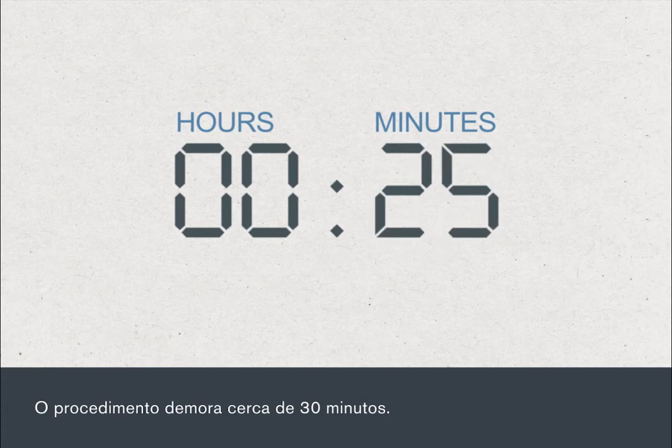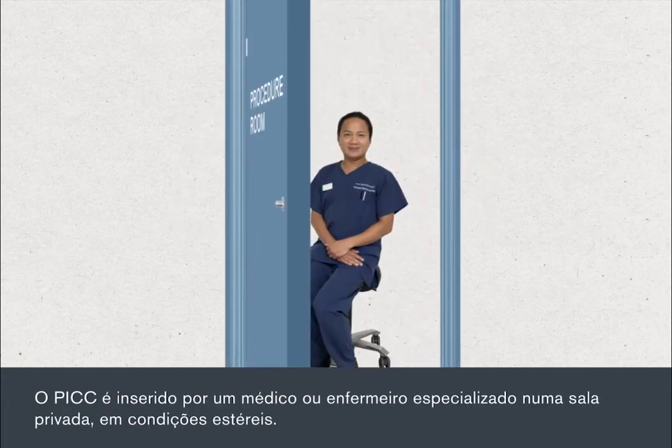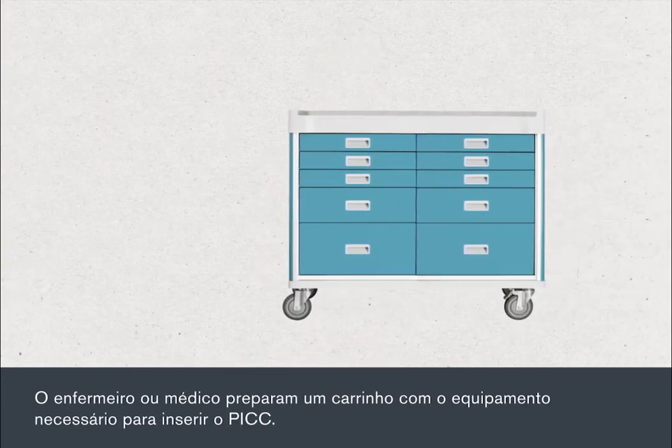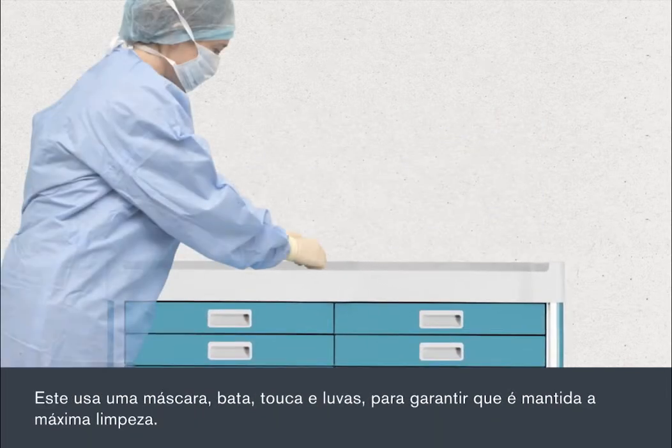The procedure takes about 30 minutes. Your PIC will be inserted by a specialist nurse or doctor in a private room under sterile conditions. The nurse or doctor will prepare a trolley with the equipment needed to insert your PIC. They will wear a mask, gown, hat and gloves to make sure that everything is kept as clean as possible.